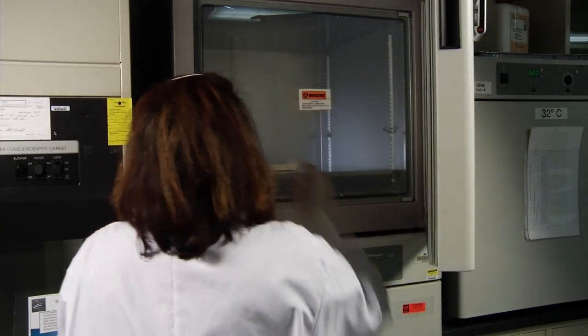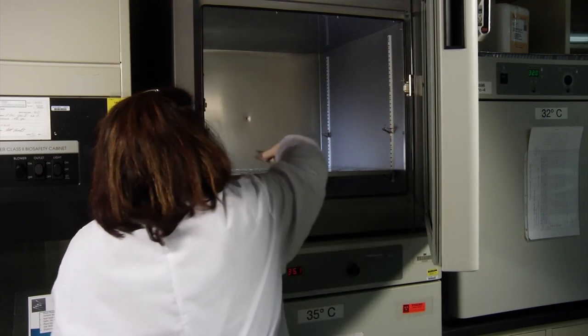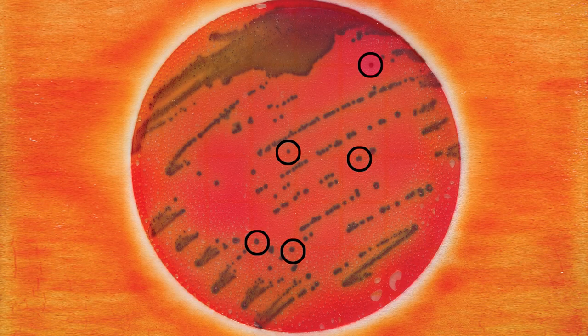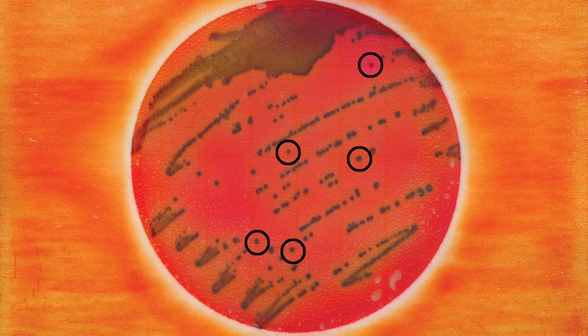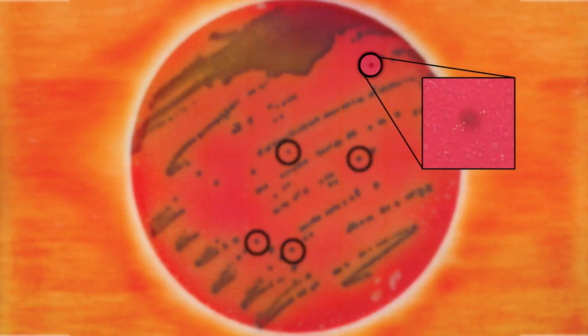After incubation, remove the disc to plate from the incubator and proceed with reading the results, focusing only on the circled colonies. Colonies that are green to blue, blue to dark blue or black or have a blue precipitate around them are biochemically confirmed positive for Salmonella species. Colonies that remain the same red, dark red or brown color without a blue precipitate are negative for Salmonella species.